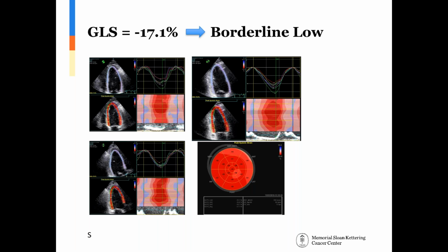One of the things that we were able to do, a little bit of a variant of what Jennifer was saying, is that we have it in the echo order for physician order entry, whether this patient's going to get chemotherapy or whether the patient has cancer. That translates onto the requisition that the sonographers will see, and that's their clue that we're interested in strain. We don't get much more specific than that, because it gets a little complicated, so we try to keep it very simple.